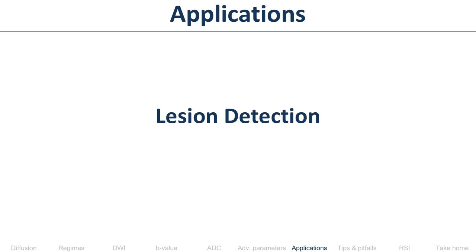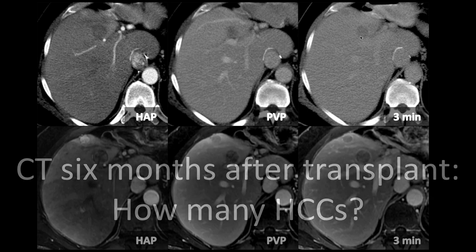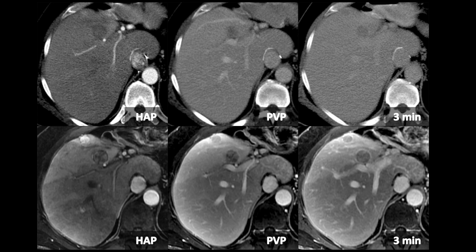So why do we do diffusion-weighted imaging? Mainly for lesion detection. Here's a patient with three HCCs. On CT you can see two of them: hyper-enhancing and washing out. On MRI done one day later, arguably you see those two better. But you only see two — anyone see a third? Once we add diffusion, there it is with the blue arrow. Now you can see it on the arterial phase and washing out on portal venous and delayed phase. I didn't see it until I saw the diffusion.